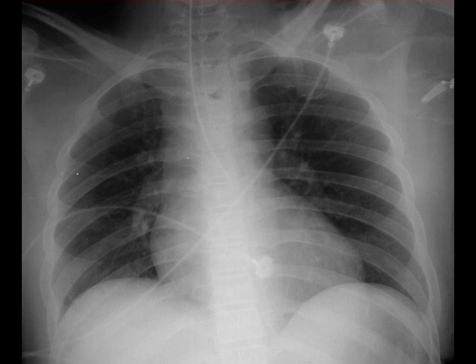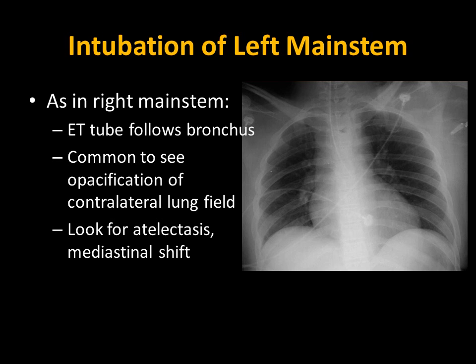Our third case is a 35-year-old female with no further history provided. We see an ET tube with a radio-dense stripe, this time with a curve to the left. Without any of the other signs of esophageal intubation, this is concerning for a left main stem bronchus intubation. This case is presented to recognize that a left main stem bronchus intubation is possible, while the right main stem bronchus intubation may be more likely.